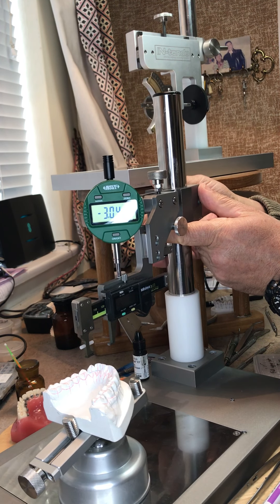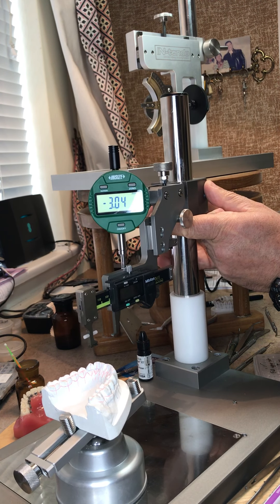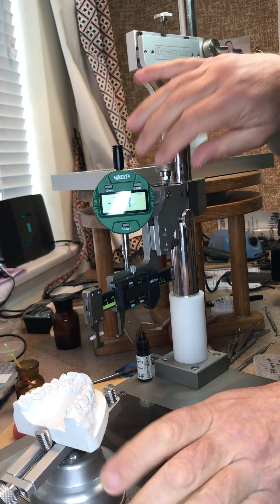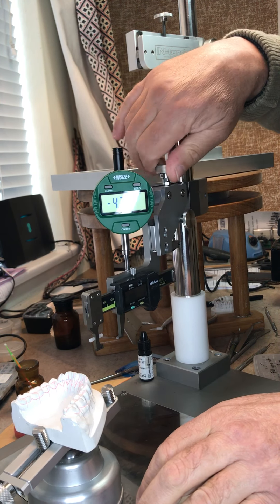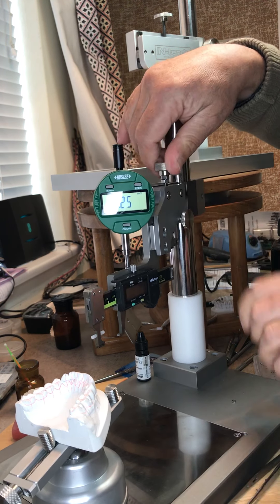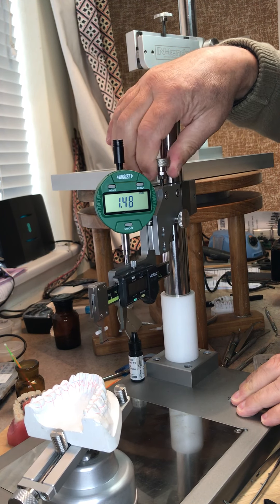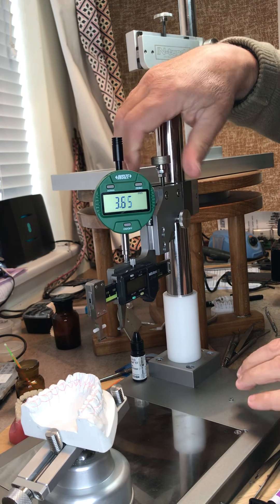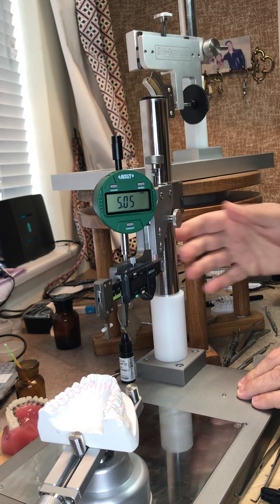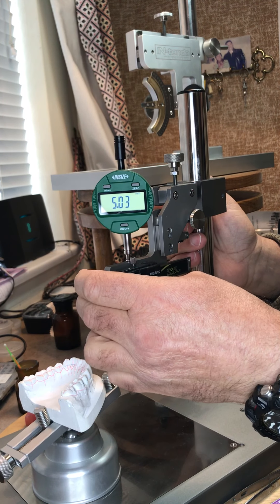I have my gross height adjustment here, which I can slacken off and slide up and down — very nice, very smooth. Then I have my fine height adjustment, so I can move this up and down to read off on the dial test indicator to a hundredth of a millimeter, which is far more than we need. A tenth of a millimeter is sufficient, but we have it, so why not.